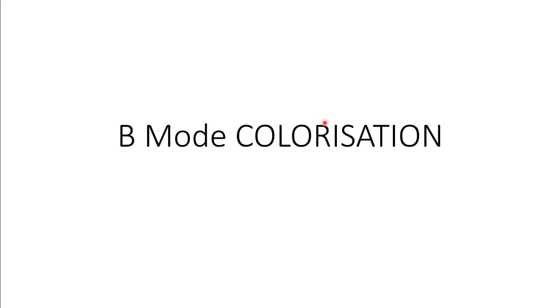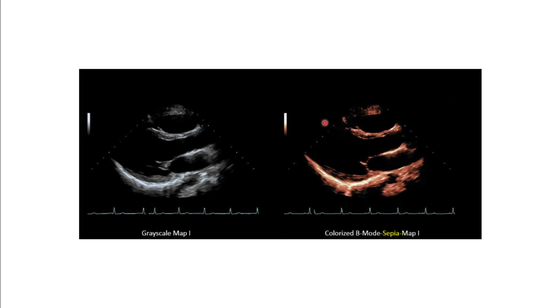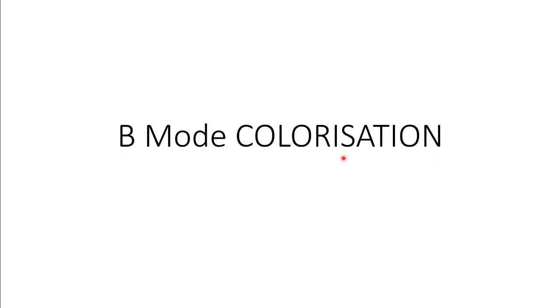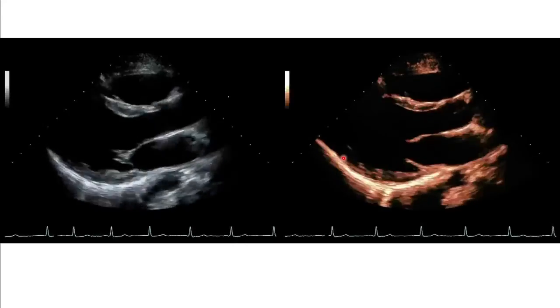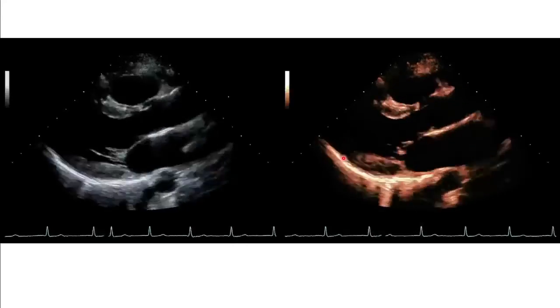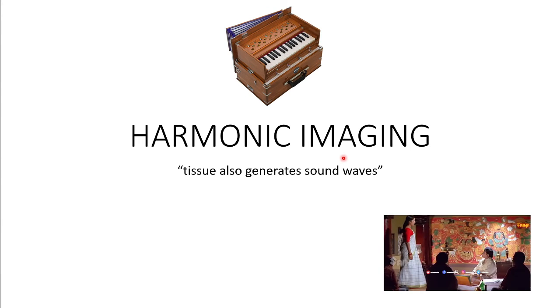Next is B-mode colorization — generally we see the echo image as a black-and-white or gray-shade image. If we apply a color such as sepia over that, certain structures can be seen more clearly. In certain scenarios we can apply B-mode colorization — a single uniform color over the image — and some structures become more visible. Various colors are available: sepia, green, etc. A cine image shows the difference between various colors applied with B-mode colorization.